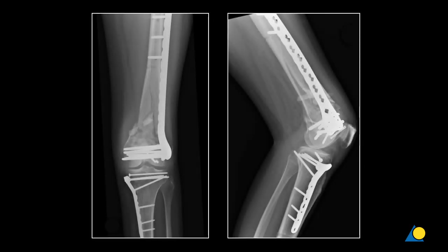Following AO fixation principles for this 3-3-C3 fracture, the articular block was anatomically reconstructed and stabilized using multiple interfragmentary screws. After restoring length, alignment, and rotation, the multifragmentary metaphyseal region was bridged using the variable angle LCP curved condylar plate.